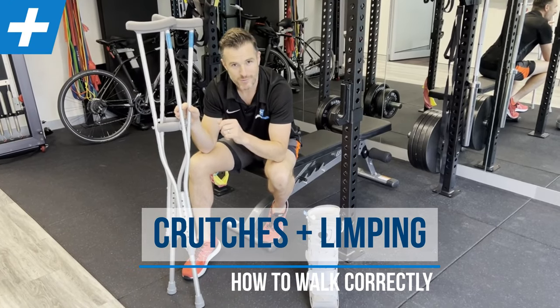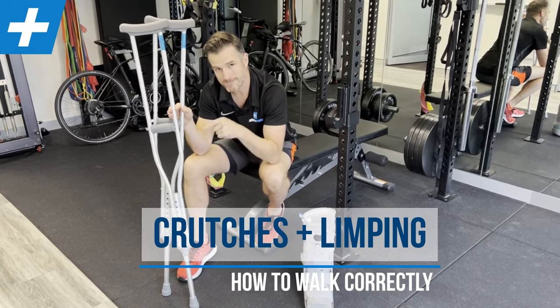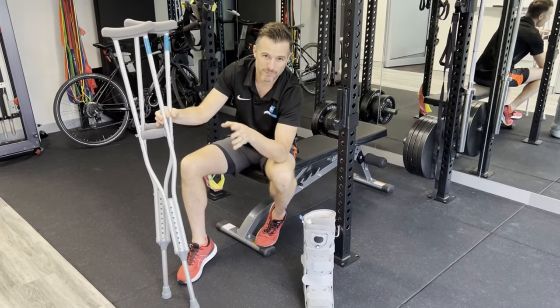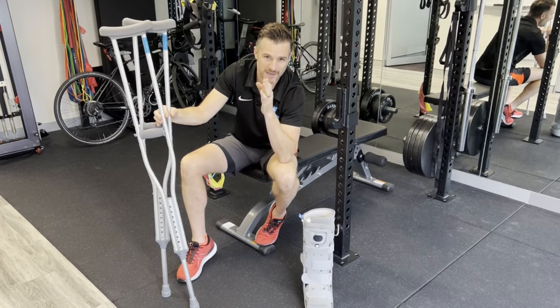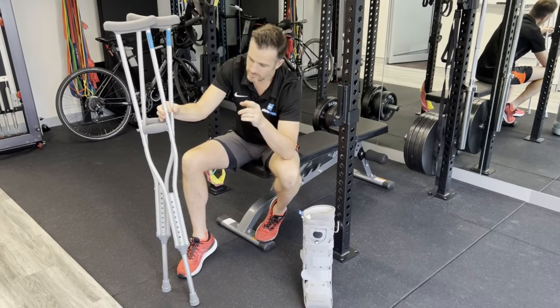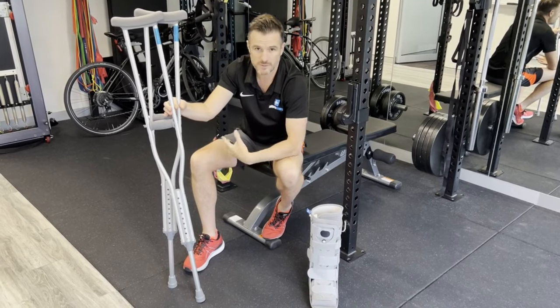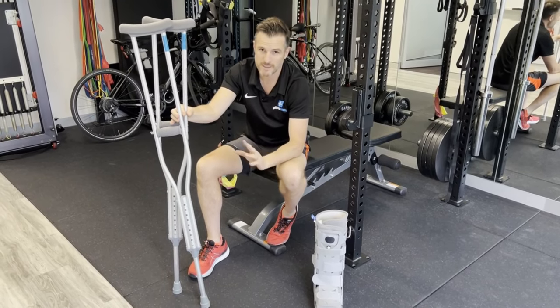We're going to go through how to walk with crutches properly, as well as when you're off the crutches, how to get rid of that limp that you've developed. Whether you're walking in a boot or not in a boot, whether you've just got an ankle sprain, the crutch walking technique is the same.